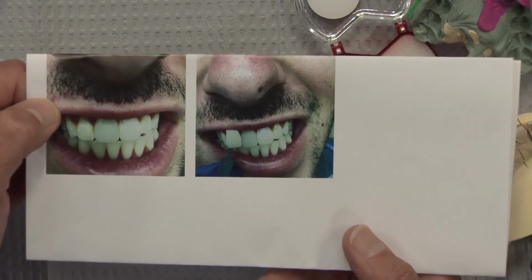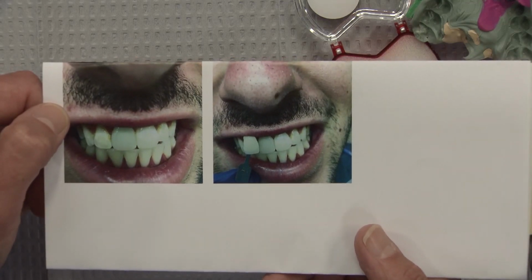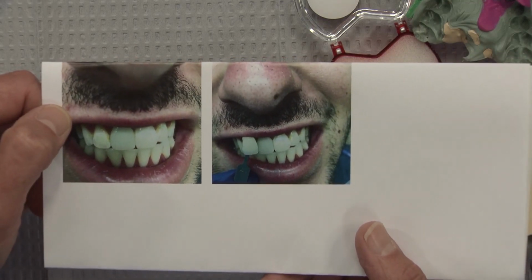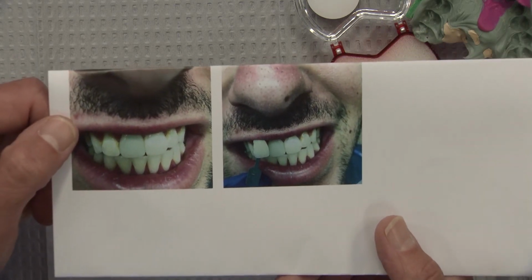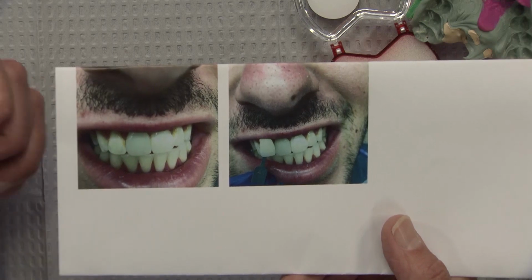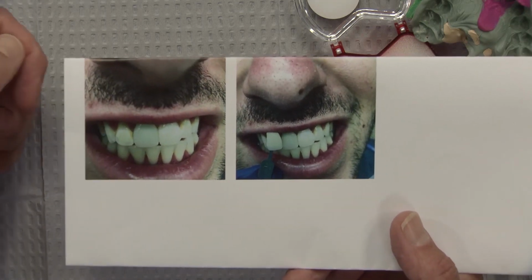This is something we know about anterior BruxZir and e.max for that matter: as you get a more aesthetic material, it becomes more translucent and as a result can show the tooth underneath it. So how, as a dentist, do you know when you have to worry about that stump shade or not?